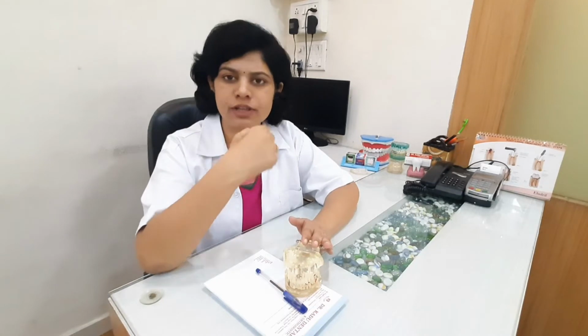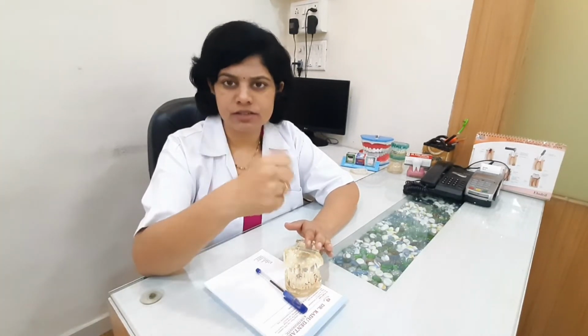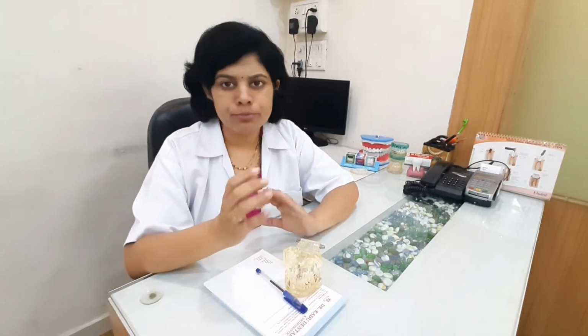Sometimes a small cut into the gums is given and a small hole into the bone is made with the help of special implant drills, and the implant is placed. The actual procedure of placing the implant in the bone might take quite a lot less time. Once the implant is placed, sutures are given.